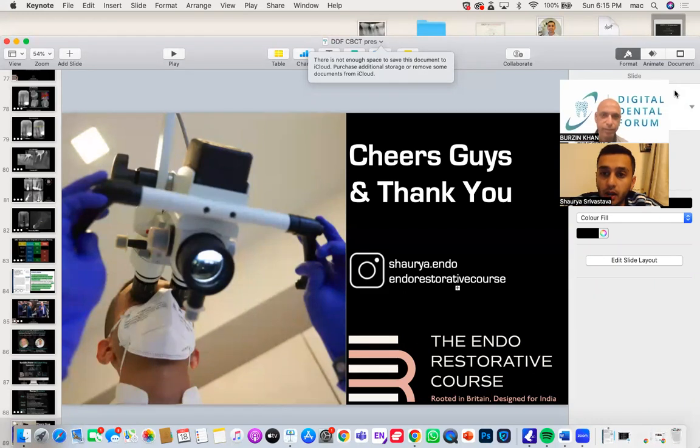Yes, guided endo has its place. There's a paper by Moreno in the IEJ, 2019-2020 as well. It's a very novel approach. We use it for cases where there are calcifications. The predictability of finding a canal ranges from about 91 to 93%, depending on what tooth you're looking at.